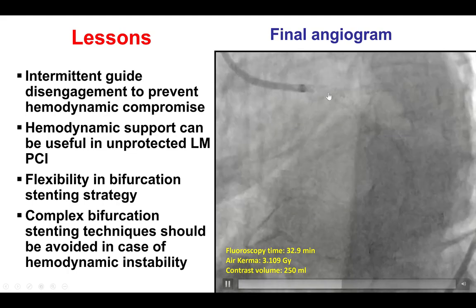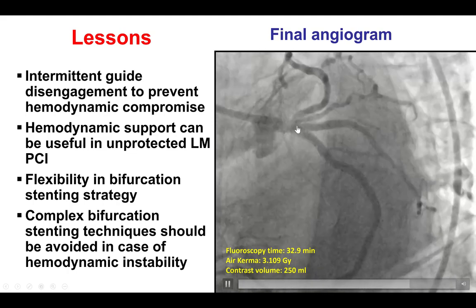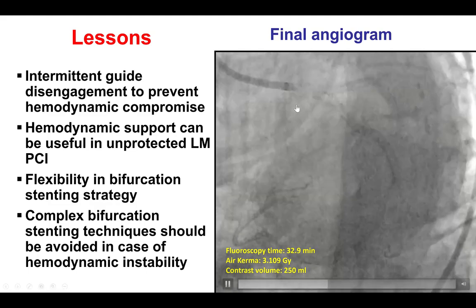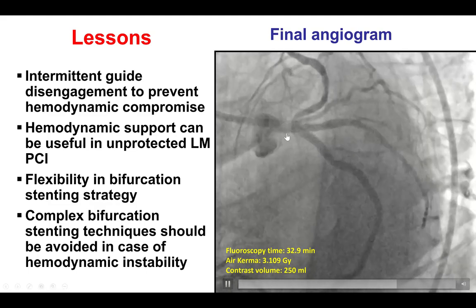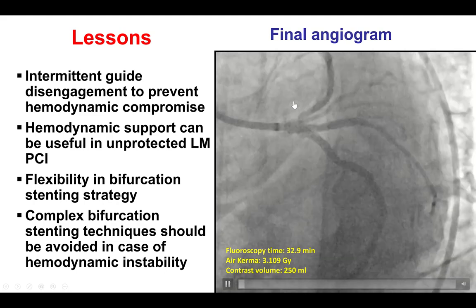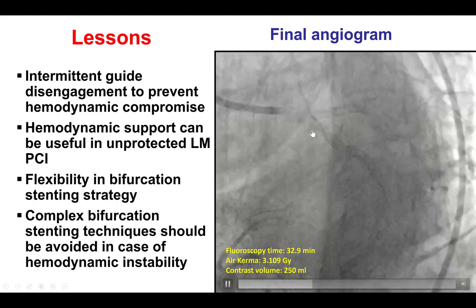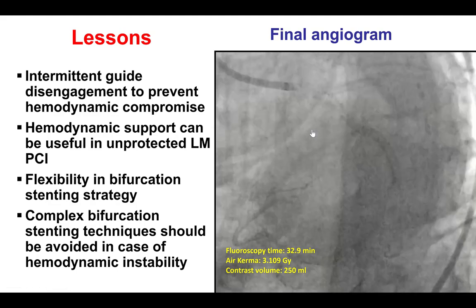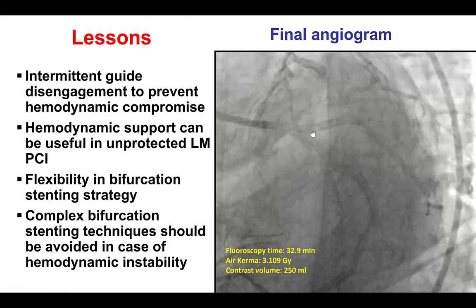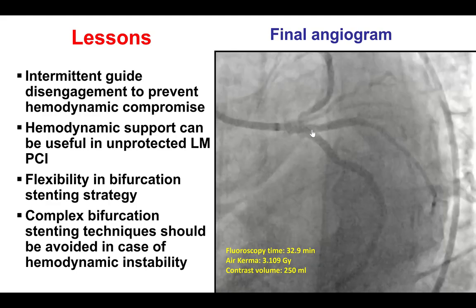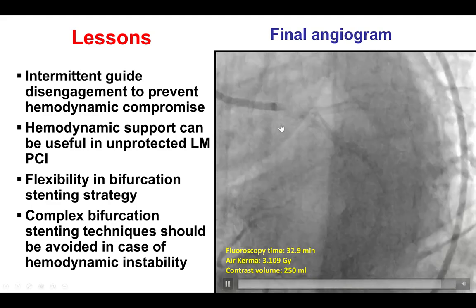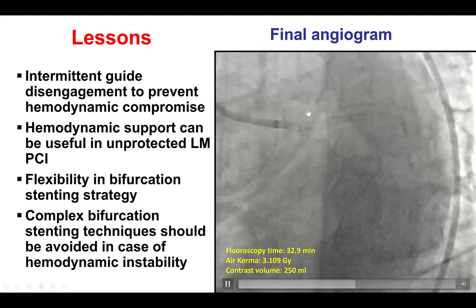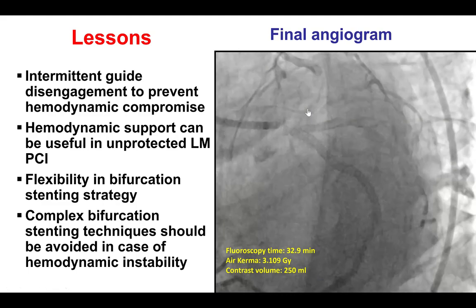However, the technique choice for bifurcation lesions should be customized to the patient's specifics. In this case, it was important to obtain good flow to the left main and its branches urgently. DK crush does take a lot of time and would not have been the optimal technique here. Converting to a standard crush technique allowed more prompt recanalization of the vessels, restoration of good flow, and maintained the patient's hemodynamic stability.